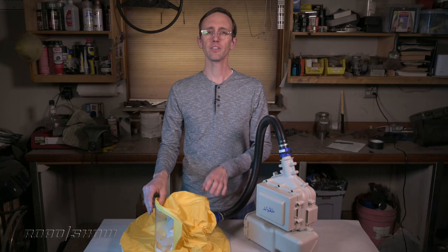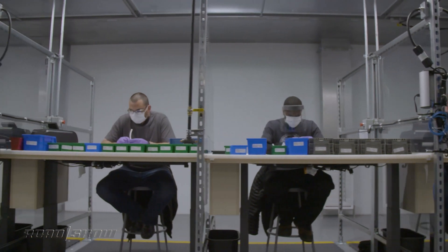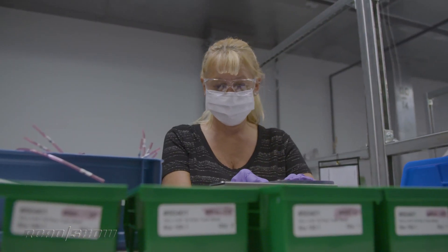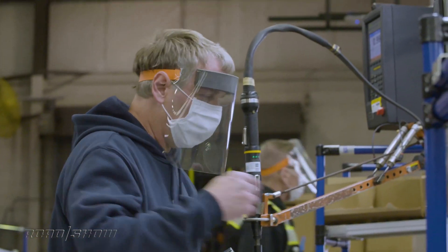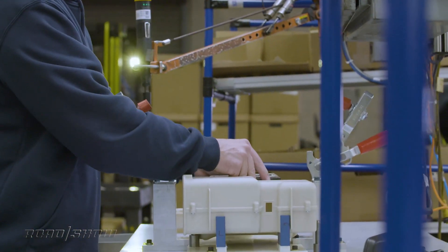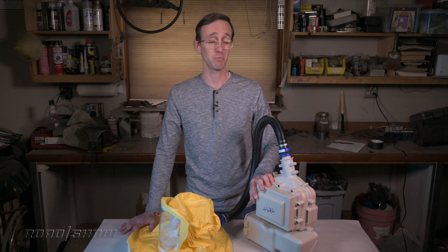The company started producing these respirators in the middle of April at a facility located near Flat Rock, Michigan, which is a little bit south of Detroit. If you know cars, you know that Ford builds the Mustang and Lincoln Continental down in Flat Rock. The company says they have enough capacity to build up to 100,000 or more of these respirators if needed, but let's hope they're not necessary.